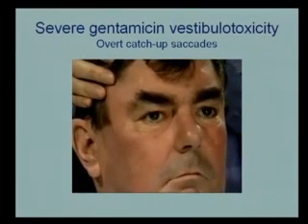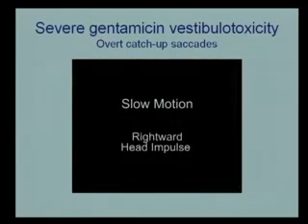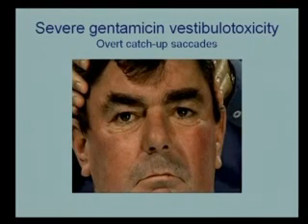In slow motion, 1, 2, 3, 4, 5, there's the catch-up saccade. This person has a severely defective, if not absent, horizontal vestibulo-ocular reflex.